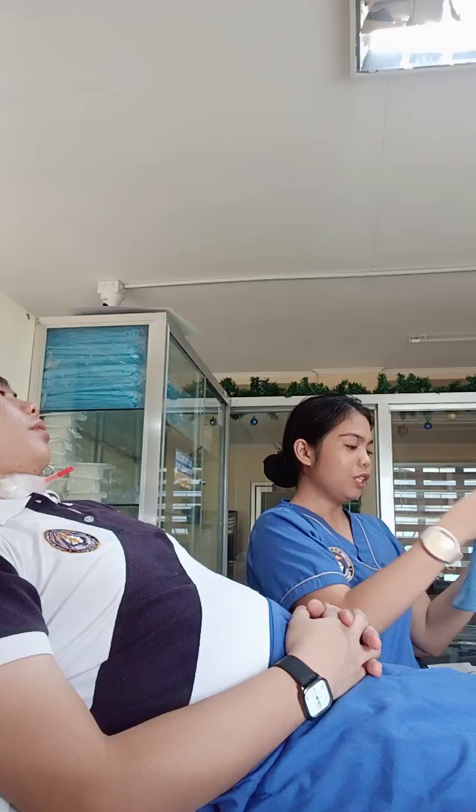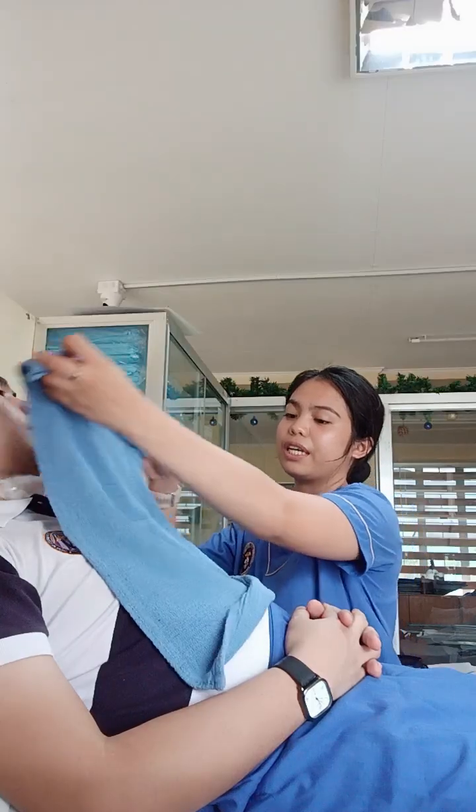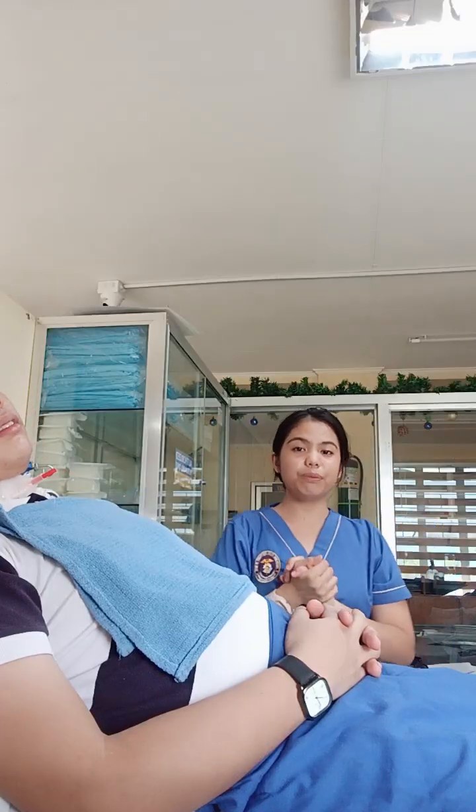So after that, we now put our towel or drape towards the client's chest and only expose the necessary area. After putting the towel or drape, now we will be donning our sterile gloves.